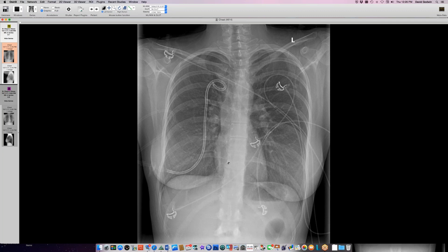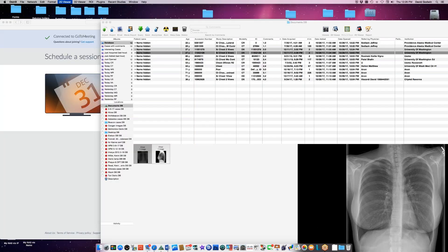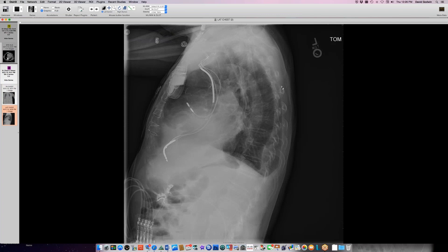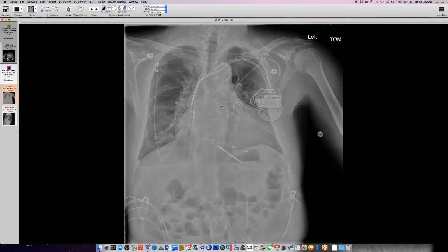Looking at some other cases of acupuncture needles — here's a case from several years ago with all of these very fine fragments of acupuncture needles in the upper thorax. On lateral view you can see these are posterior in the posterior chest wall. There are different styles of acupuncture — sometimes needles are rotated, connected to an electrical source, or heated. Sometimes they have a very thin portion near the tip that they break off and leave in place. The finest of these needles were probably designed to be left in place, and so some acupuncture needles are retained and show up as foreign bodies on chest radiographs.